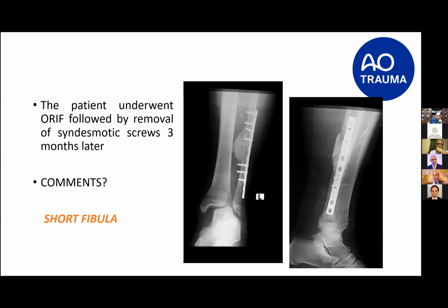The surgeon put some bone substitute, like a whole mass, and filled the comminuted fracture with this material without controlling the length, without controlling the rotation, just to have a mass of bony union without bony alignment. So that was a very big mistake. And when the surgeon removed the syndesmotic screws, the talus tilted into valgus because there is no lateral support.